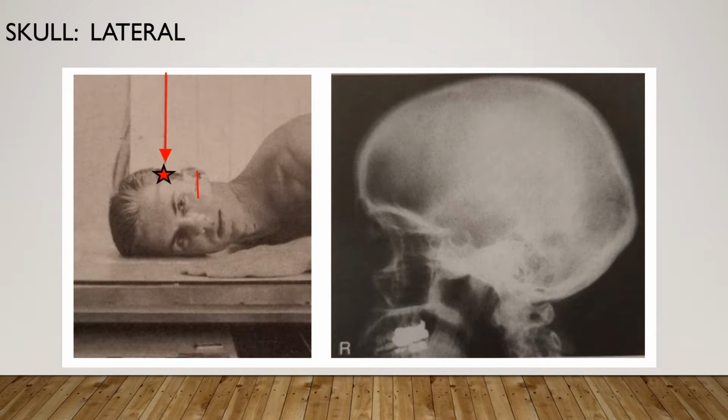The entire sella turcica and dorsum sellae will be in this particular position. There will be no tilt evident by superimposition of the orbital plates or the roofs. No rotation is also evident by superimposition of the greater wings of the sphenoid and mandibular rami. Optical density or brightness and contrast are going to be adequate to visualize the cranial structures. Sharp bony margins and no motion.